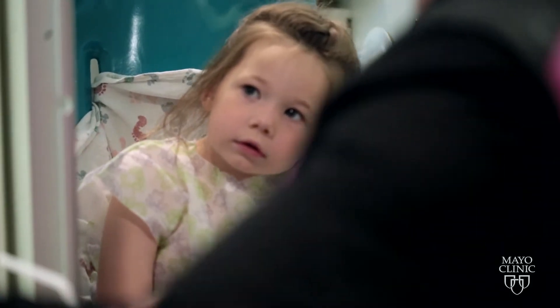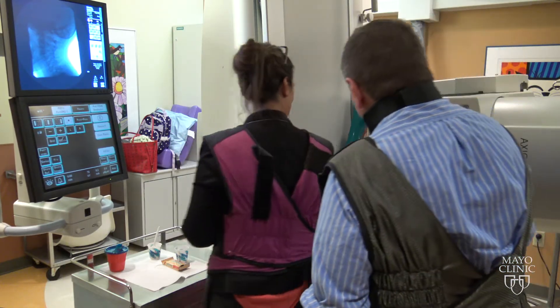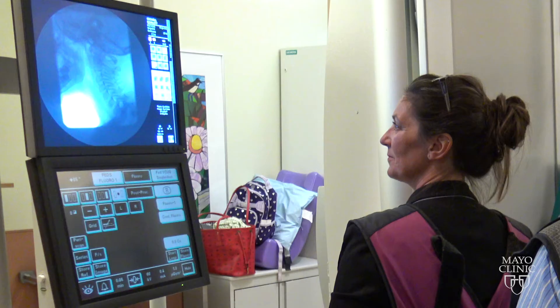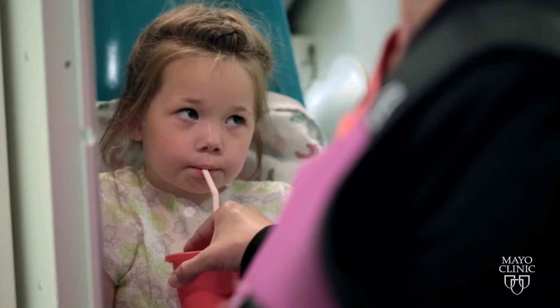So there you are. Okay, you ready? Here we go. Stay still and drink. Good job. Good job, Scarlett. Can you take a few more of those for me?